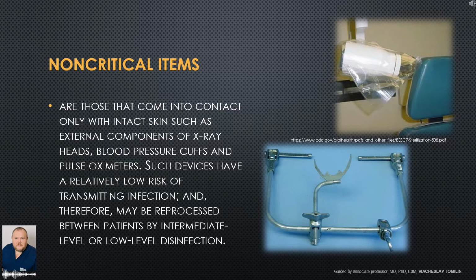Non-critical items are those that come into contact only with intact skin, such as external components of X-ray heads, blood pressure cuffs and pulse oximeters. Such devices have a relatively low risk of transmitting infection, and, therefore, may be reprocessed between patients by intermediate-level or low-level disinfection.